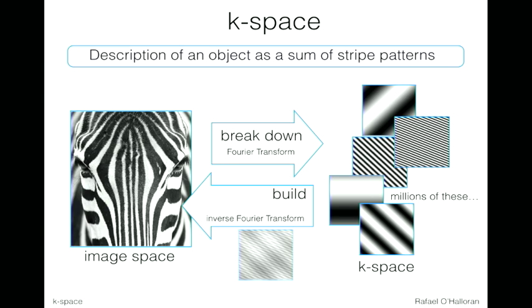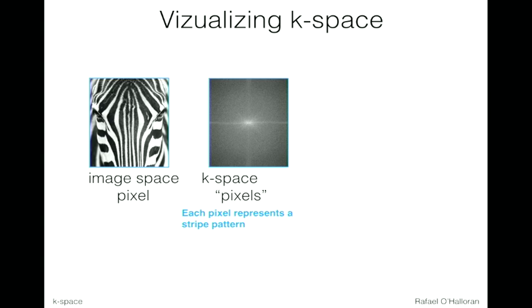And this is typically what we mean when we talk about reconstruction or image reconstruction in an MRI. And interestingly, a lot of people that I know don't like the word reconstruction because the image was never constructed in the first place. You're constructing it for the first time. So these people say it should be called construction, but that's just an aside.